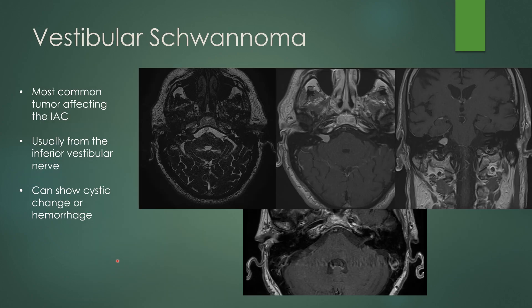Vestibular schwannoma is the most common tumor affecting the IAC. It usually arises from the inferior vestibular nerve. When they get big, they can show cystic change or hemorrhage. The classic appearance on IAC imaging is an ice cream cone-shaped mass widening the porus acusticus with enhancement extending into the internal auditory canal and into the cerebellar pontine angle. Here it is on the coronal view, homogeneously enhancing, although it can be heterogeneous. A purely intracanalicular vestibular schwannoma — a nodular focus of enhancement within the distal IAC — can result in pulsatile tinnitus because the tumor has vascularity going to it.